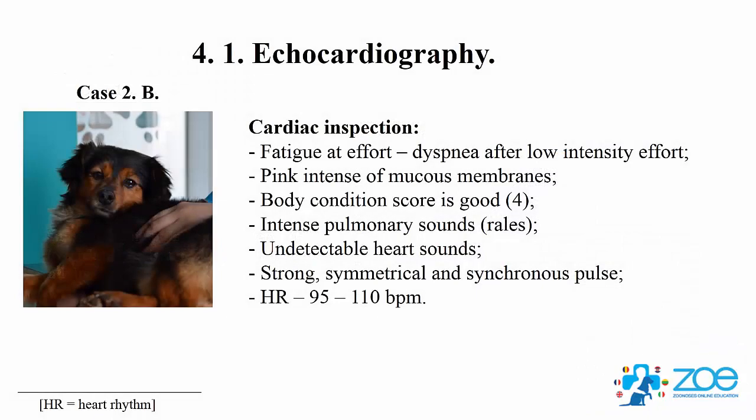Echocardiography. Case 2. Cardiac inspection. Fatigue at effort. Dyspnea after low-intensity effort. Intense pink mucous membranes. Body condition score is good.